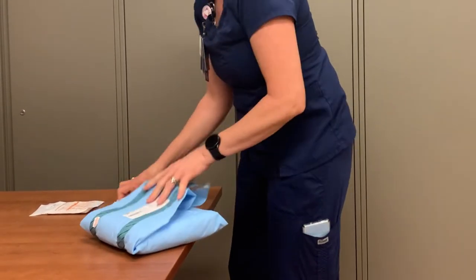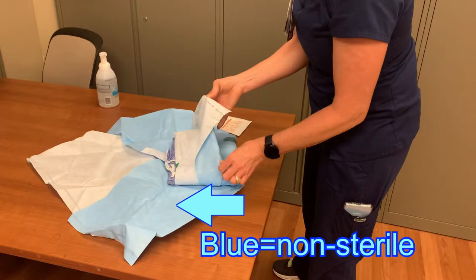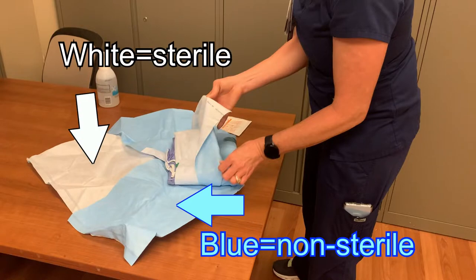At this point, your hands are not sterile. You can touch non-sterile surfaces and supplies, but if you touch anything that is still sterile, it will be contaminated and you will need to restart with new supplies. The outer wrap is blue on the outside and white on the inside. You can touch the blue side with your hands, but do not touch the white surface of the wrap.